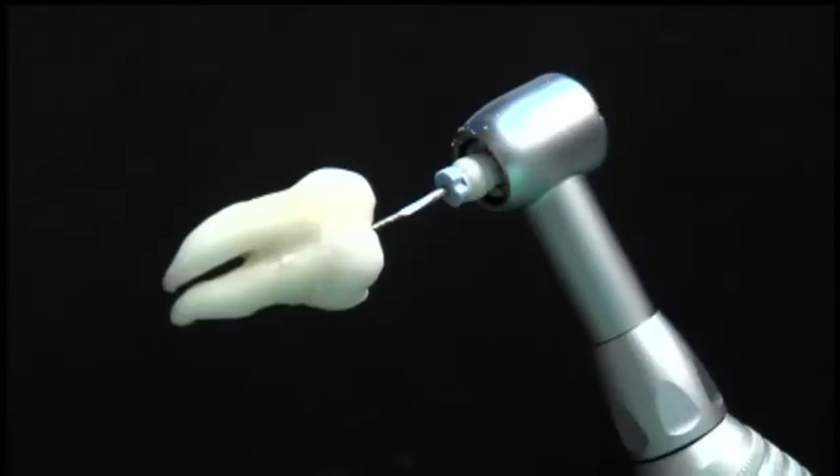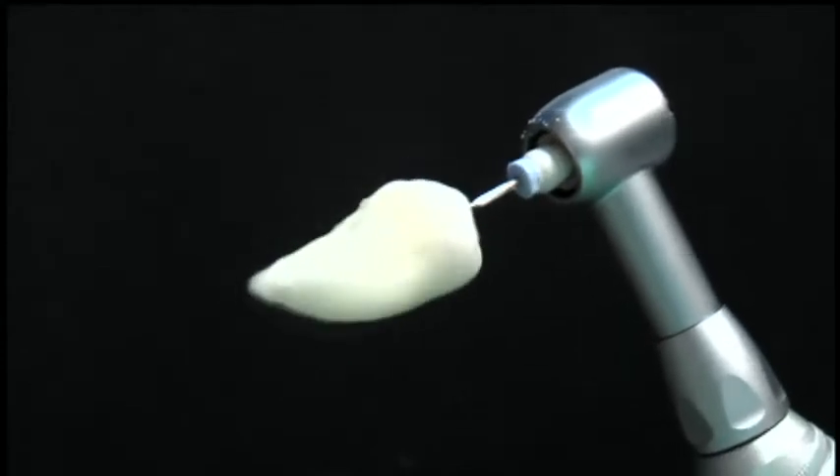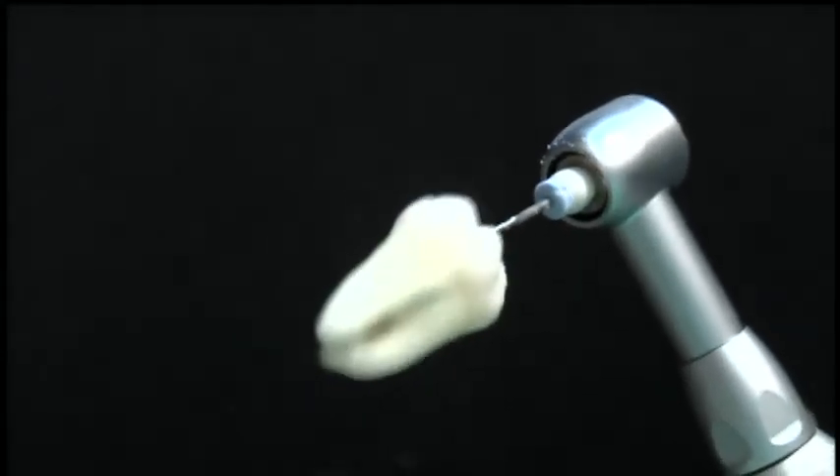The EndoGripper reduces hand fatigue, saves you time at the chair, and just makes your endodontics a whole lot easier. You ever get down one of these little curved areas, get right to the end, and you're able to get down the canal with your file, but then you can't get back down it? Well, what you can do now is slip on the EndoGripper, grab hold of the file, and the vibrations will sand away the inside of the canal and take away that curve. The next time you have trouble getting down the canal, grab the gripper and you'll find it makes it very, very easy to get to where you're going.